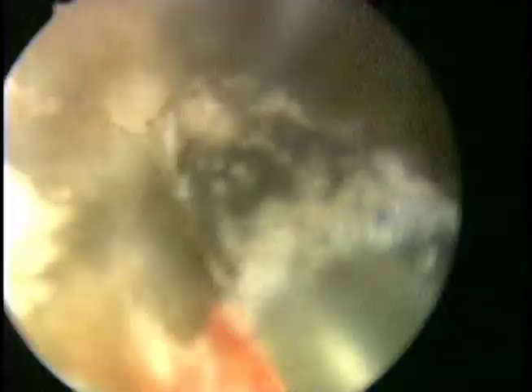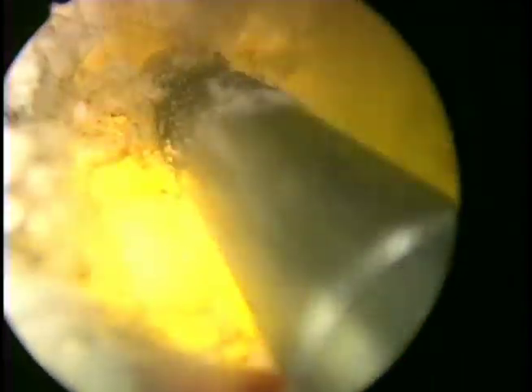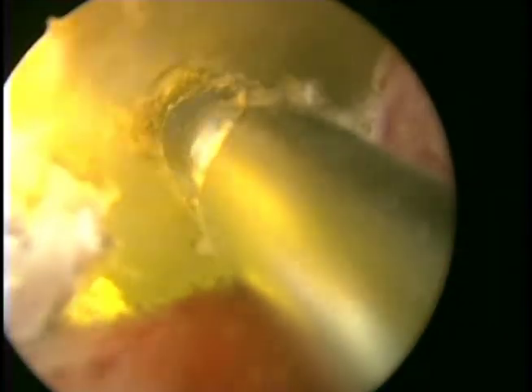Care is also made near the apex, and this to me is the biggest challenge to BPH surgeries. There's a fine line between it and the sphincter, and overtreatment and potentially beyond the apex will lead to incontinence. Of also importance is it is the area that is most commonly undertreated by surgeons, and the reason why is that concern for incontinence, and as we know, for those that we've retreated, the most common areas that are undertreated or have regrowth are the apices. So it's important to make sure to park this camera near the verumontanum and really vaporize and treat the tissue lateral to the verumontanum, what is sometimes called the lonely verumontanum, and deobstructing the prostatic channel with proper and adequate apical dissection.